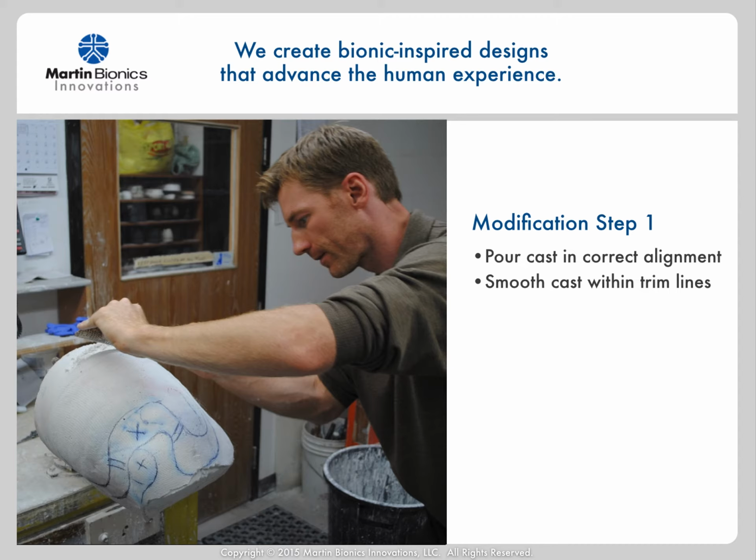Any weight-bearing areas are going to be within the fabric, not the stabilizing unit frame. Practically, the patient will be able to gain or lose a considerable amount of weight, and the stabilizing unit should still fit.